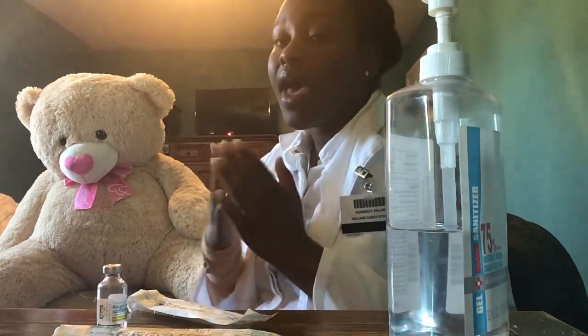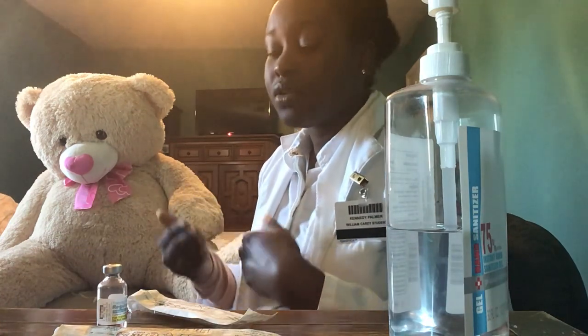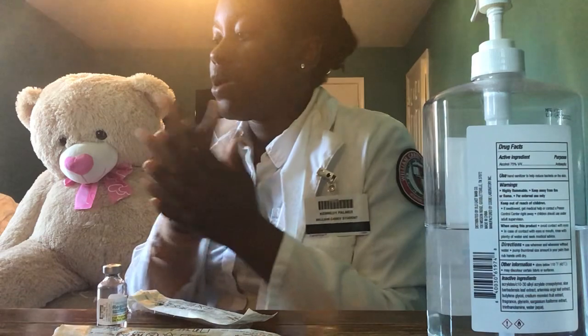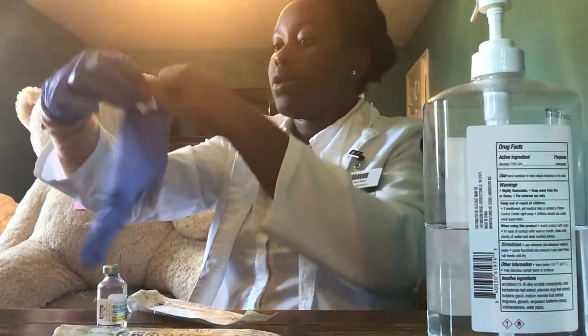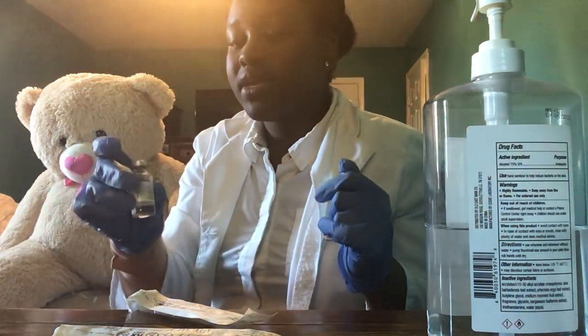Okay, thank you. And I would just compare Haldol with other medications to make sure that these medications don't interact to cause the patient dysrhythmias or arrhythmias. Okay, and I'm just going to perform hand hygiene. I have clean gloves here. And I have my medication of Haldol.